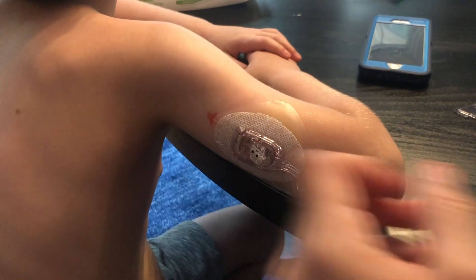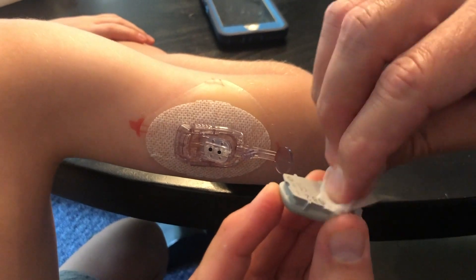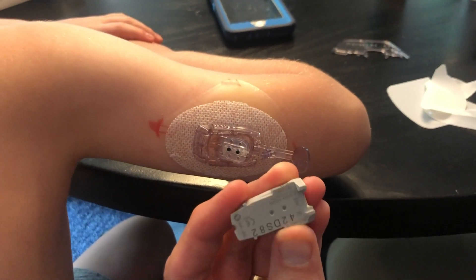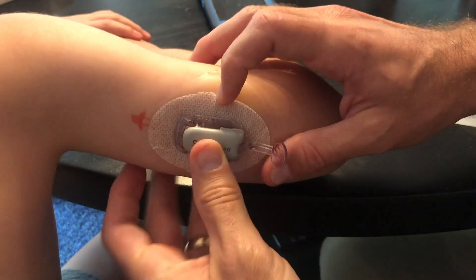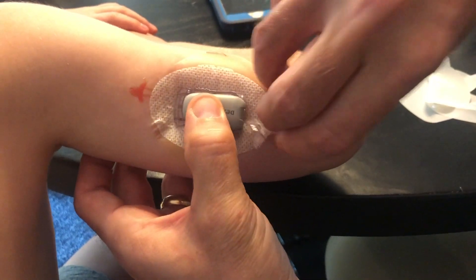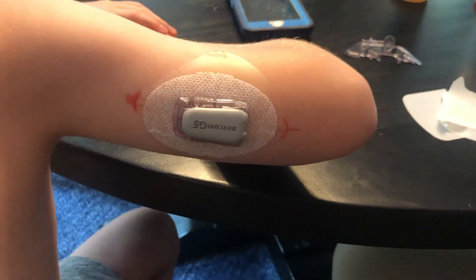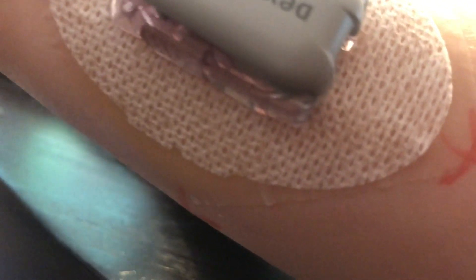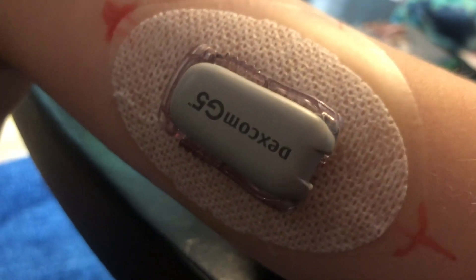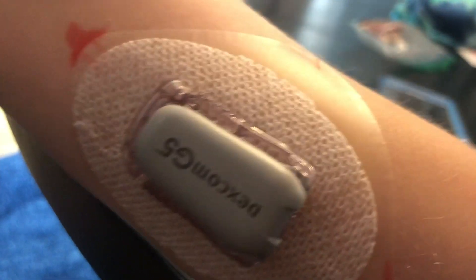Now that it's in place, take the transmitter — which we've wiped off with alcohol to make sure it's clean — and clip it directly into the sensor. With this barrier in place, no part of the sensor adhesive is touching his skin at all. We've been using this method for about five years now and have never seen a rash from it, so hopefully it works for you.